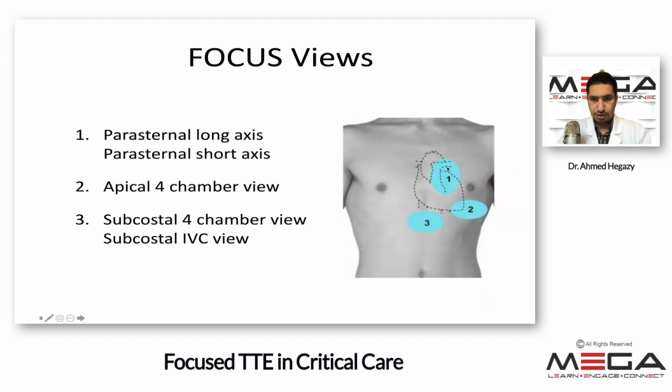I usually start in the parasternal area and move clockwise. So I start at point number 1, parasternal, go apical, and then go subcostal.